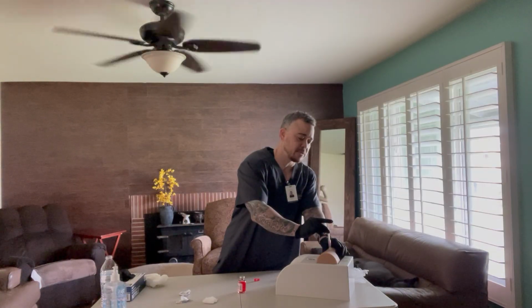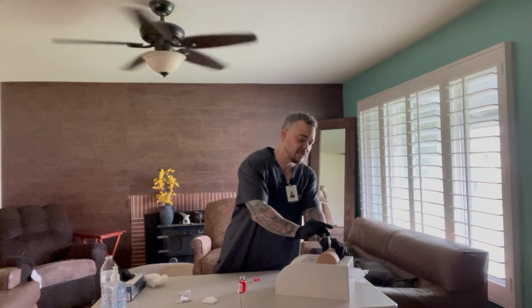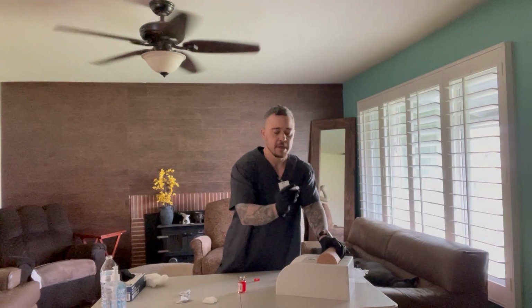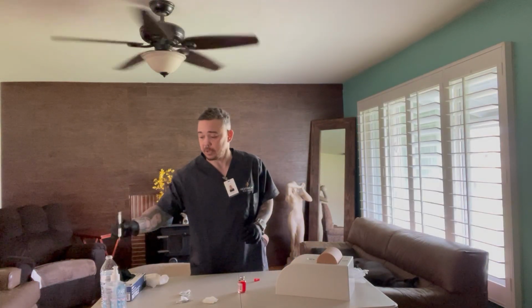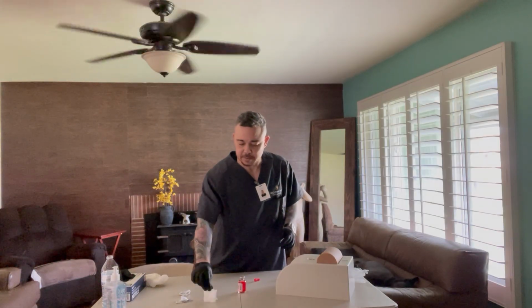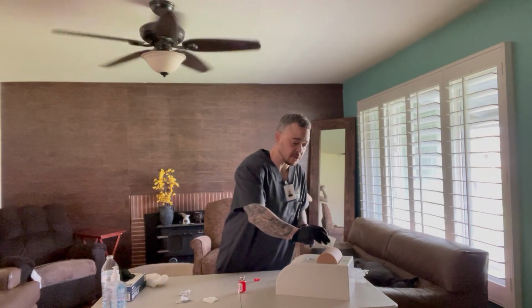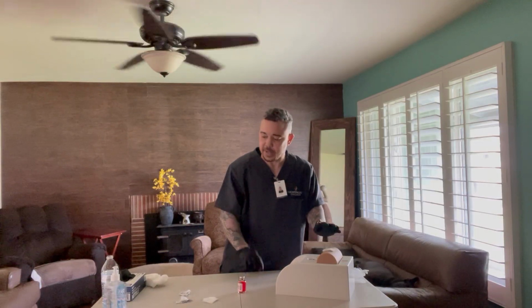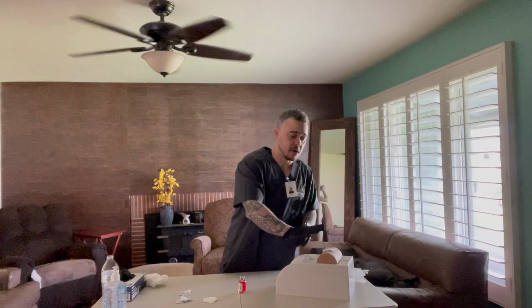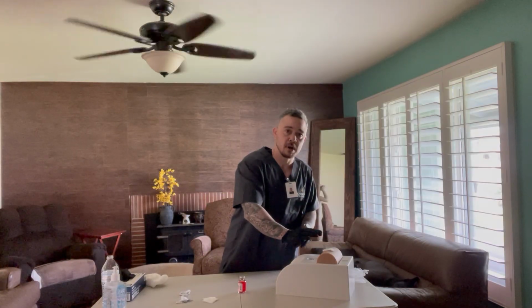Okay, so for the purpose of the video, I have inserted it. It's been 30 seconds, so I'm going to take that out. And then I'm going to drop the needle into the needle receptacle without the cap on. I'm going to take the gauze, put the gauze on top, and put the cap into the receptacle as well. I'm not going to push on the gauze. I'm not going to rub the gauze as well.